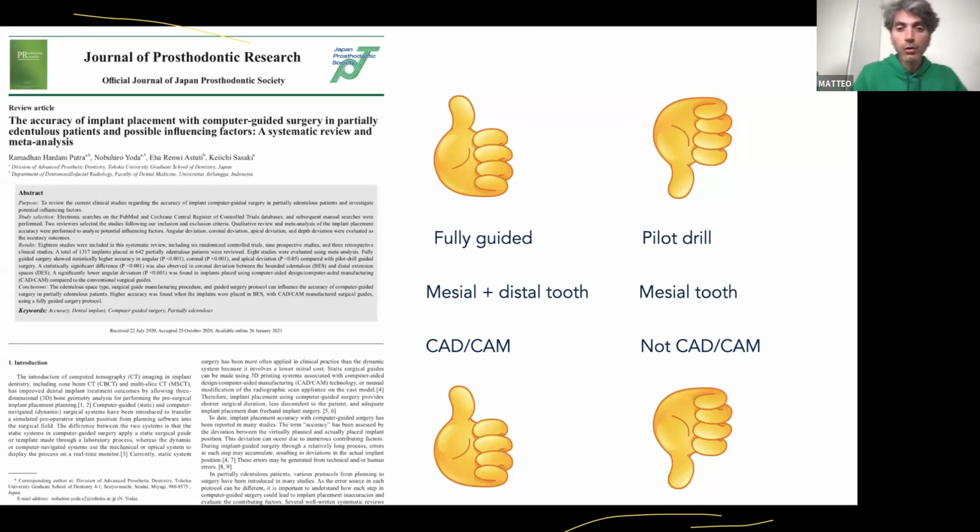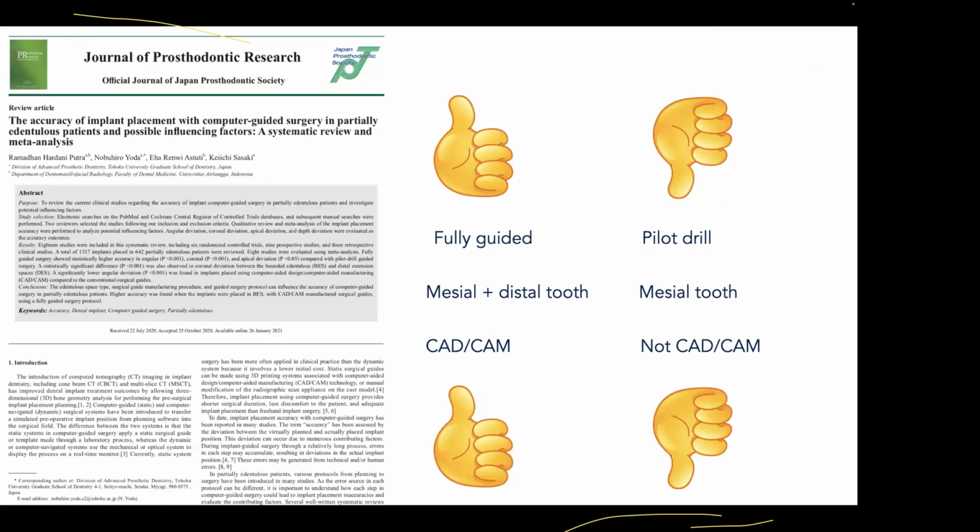So we know that the fully guided protocol is even more precise than using only the pilot drill and then using the final drill of the implant freehand. Да, и также мы знаем по данным литературы, что когда мы идем по полному протоколу навигационной хирургии, это будет давать более точный результат по сравнению с шаблоном только для пилотного сверла, а потом дальнейшее сверление без шаблона.